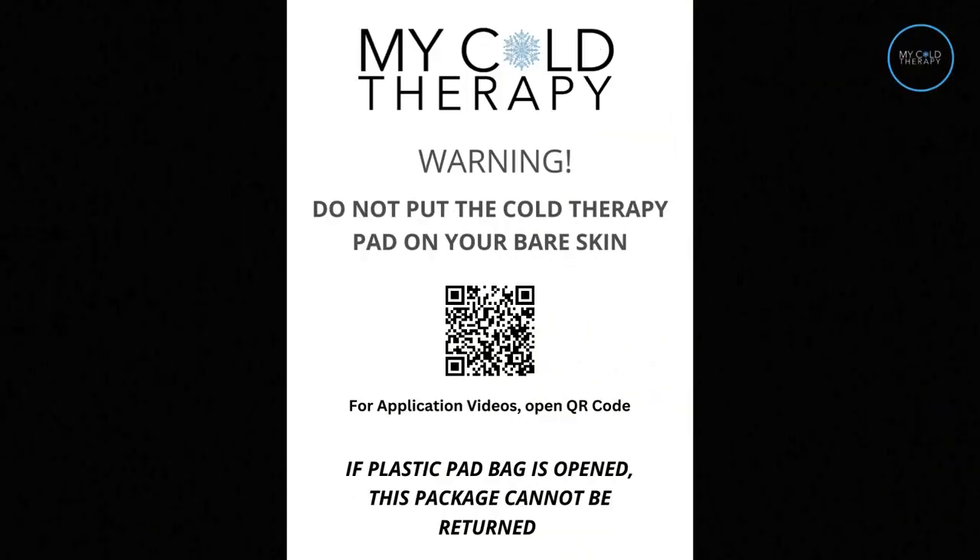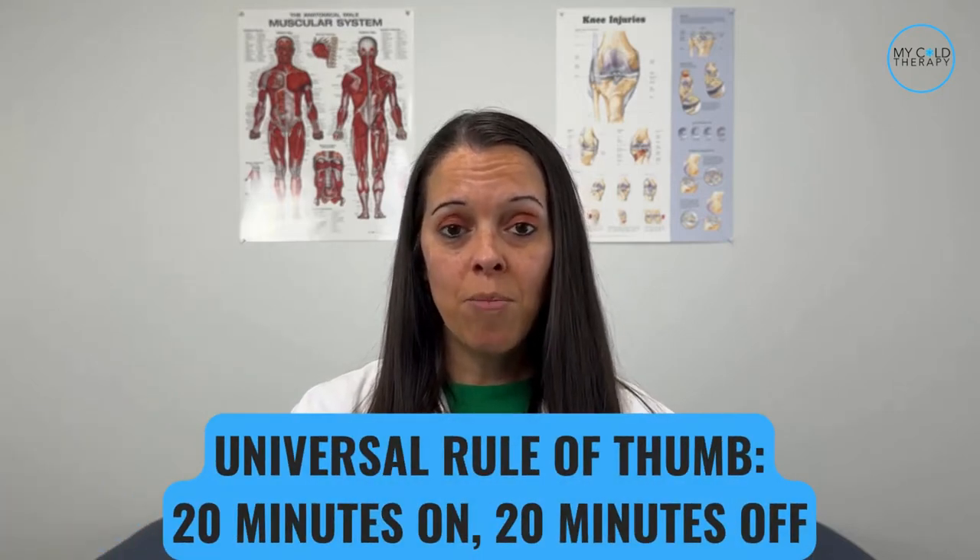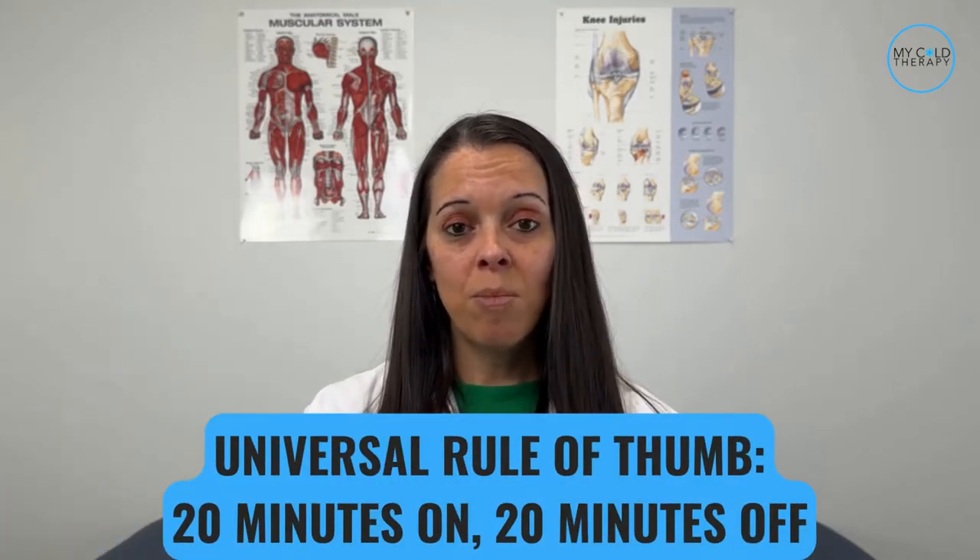The other item you're going to get is a skin warning flyer. You never want to put the cold pad directly on your skin as it could cause some damage or frostbite. The universal protocol for cold therapy is 20 minutes on, 20 minutes off. Also, please make sure to check with your doctor for any other instructions while you're using the cold therapy device, just to be on the safe side.